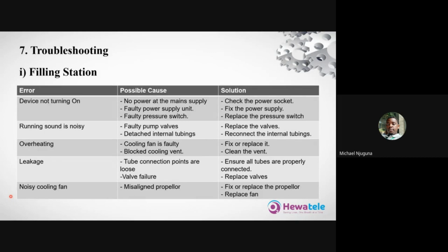Another area is that the running sound is noisy. The running sound, of course, here is the compressor, and it could have faulty pump valves. Replace the valves, or you can also replace the pump, depending on the status of the pumps.